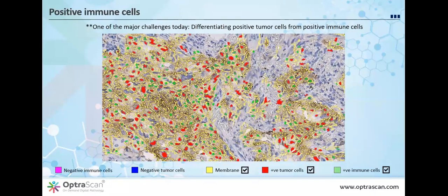Even today, when I work with Dr. Taylor on some case reporting, scoring, etc. for PD-L1, there are instances when we're like, this might be tumor. Oh no, must be immune, but I don't know. Today, there is a strong need and demand for something that could help mitigate this challenge. Something which might be really challenging to the naked eye could be made easier with the help of such tools.